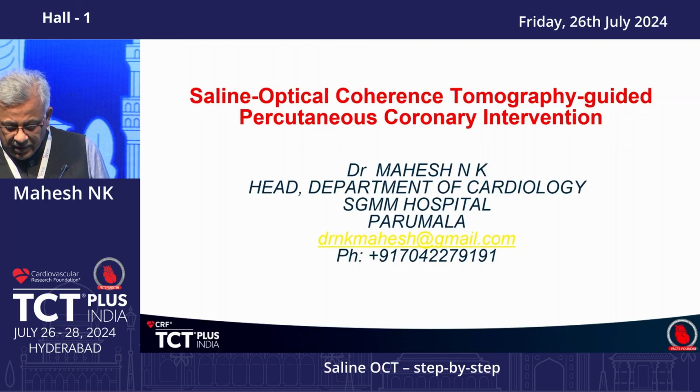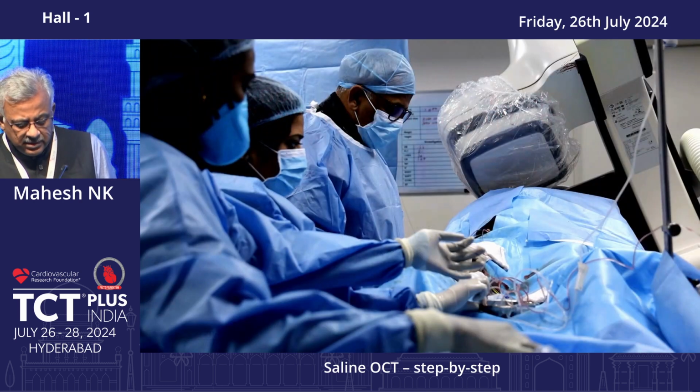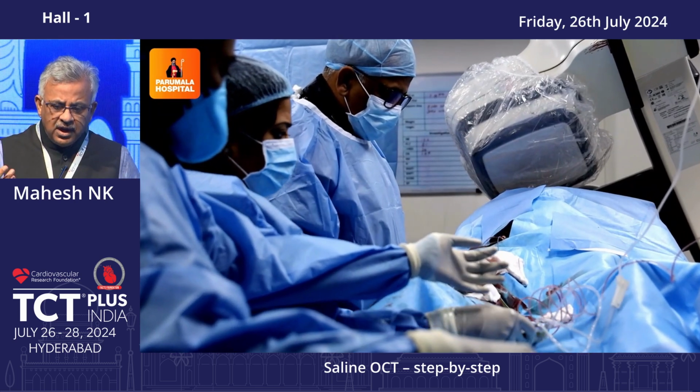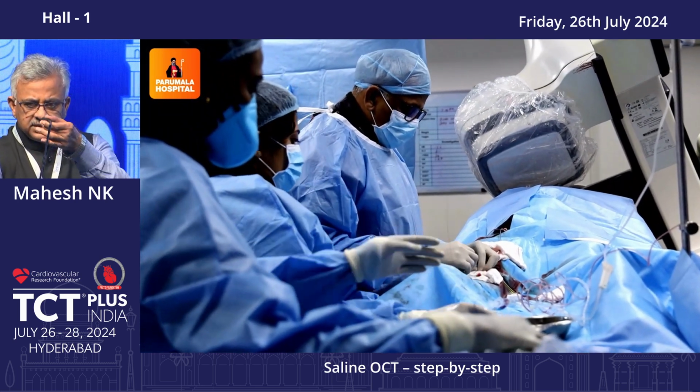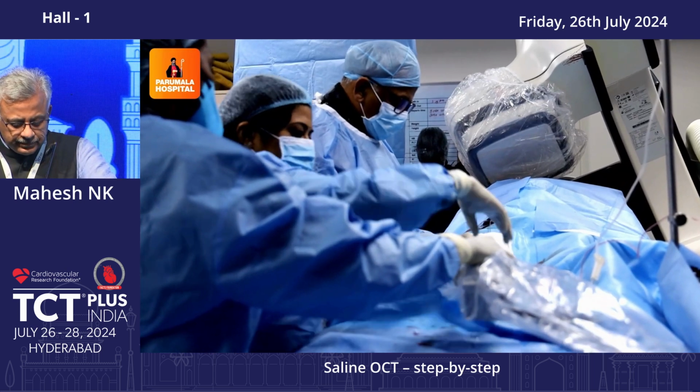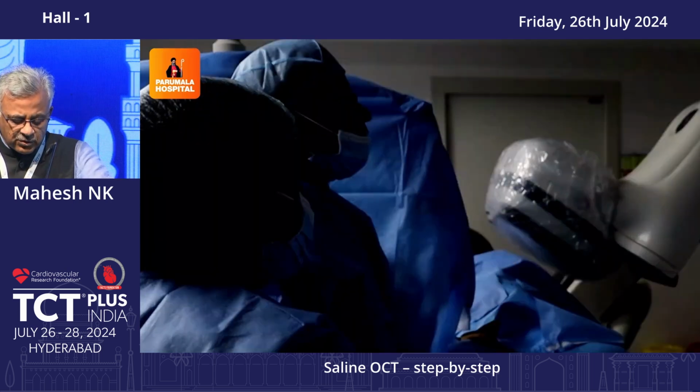I'll straight away go to the crux of my presentation. It's a case in a box I have recorded, because there's no other way to explain to you how to do saline OCT. This is just a normal way of introducing the OCT catheter.